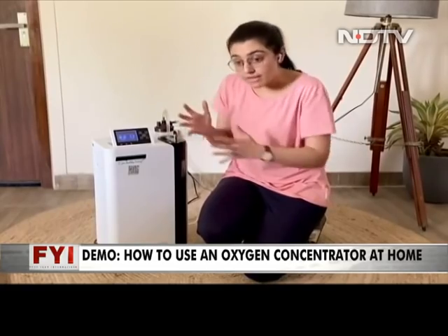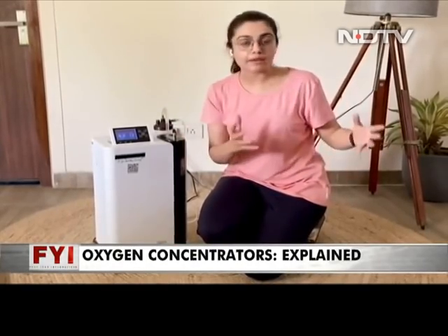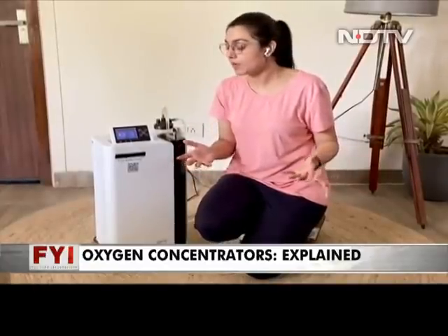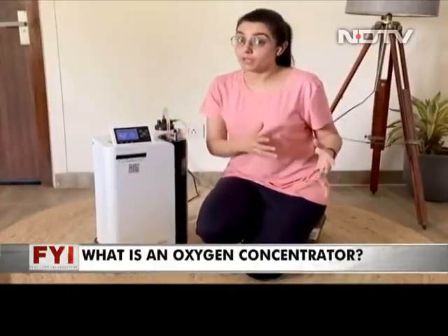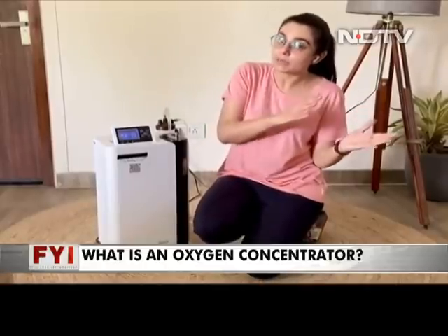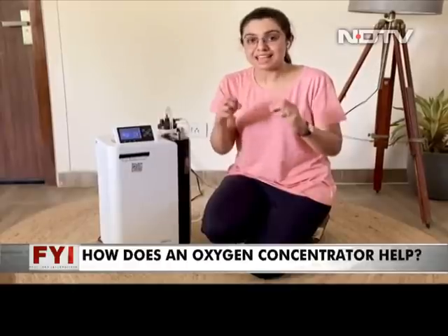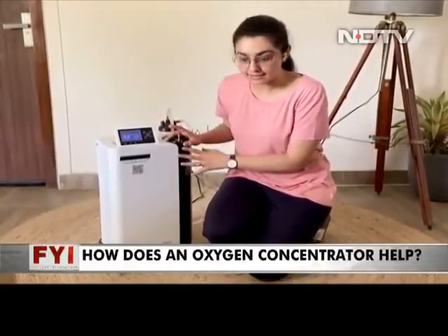So, during the time you're waiting for the ambulance to come, waiting to get a bed, etc., which is the reality of a lot of us here in the country at the moment, ensure that you do this along with proning. We've done a video for that separately as well. So if you do sideways proning with an oxygen concentrator connected to you, that's when you really get the maximum output from a machine like this.